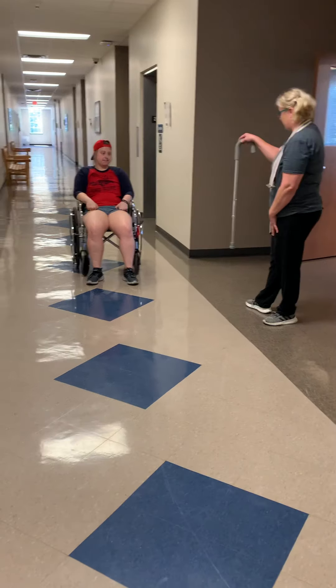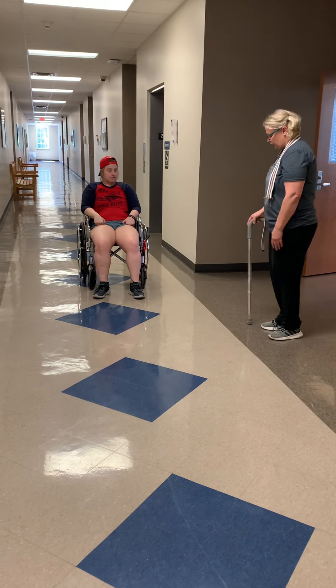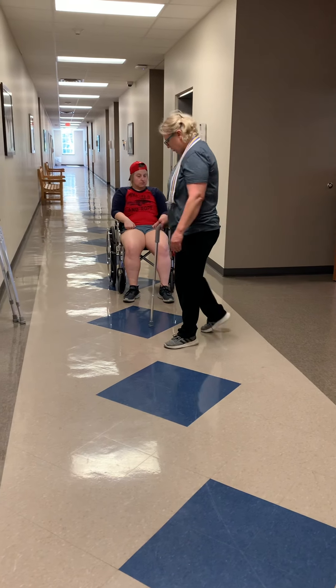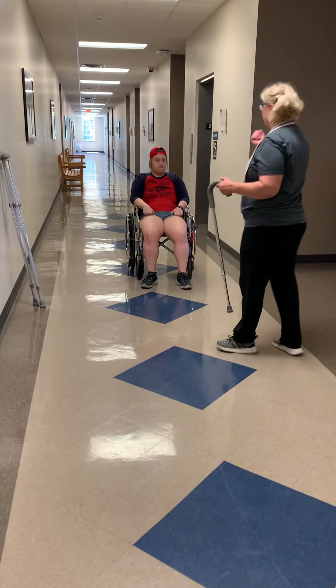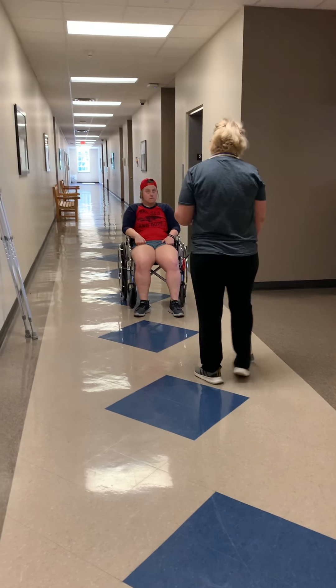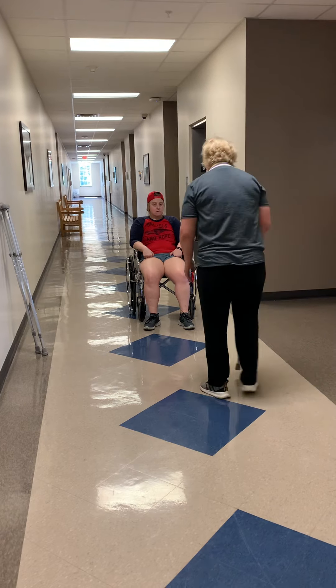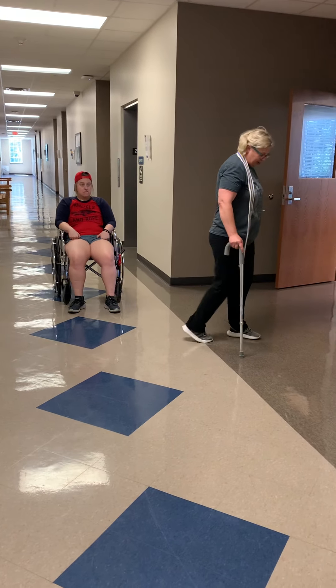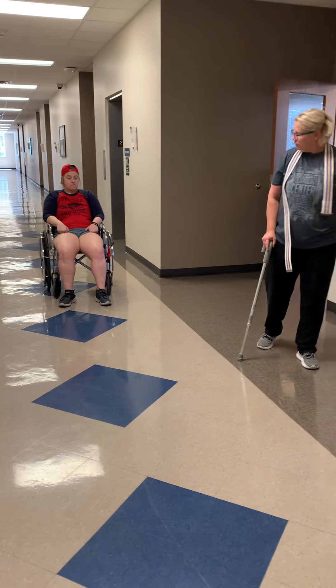Your right side. Okay, so we'll have the cane in your right hand. When you start walking, you're just going to advance the cane with your left foot, and it just gives you a little bit of stability. And when you're going to turn, we always want to turn into our strong side, which would be your dominant side. So the same way you're going to walk with the cane, advance with your left foot. Is that okay?